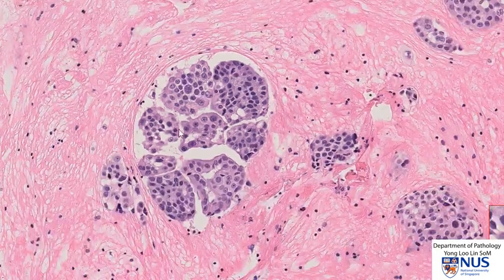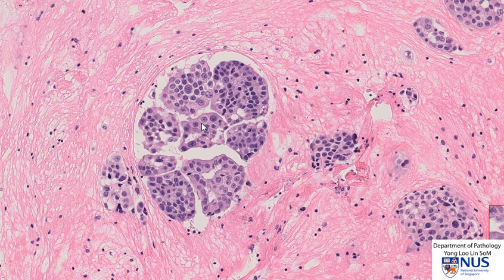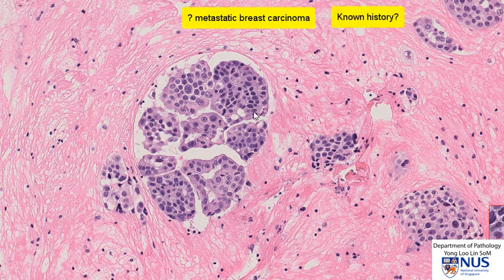This appearance — with the very rounded cell clusters that resemble cannonballs and with many nuclei within each cluster — is very suspicious for metastatic carcinoma. In particular, the cannonball appearance would always make us worry about breast carcinoma. The next step would be to find out the history, and indeed this patient does have a history of breast carcinoma.